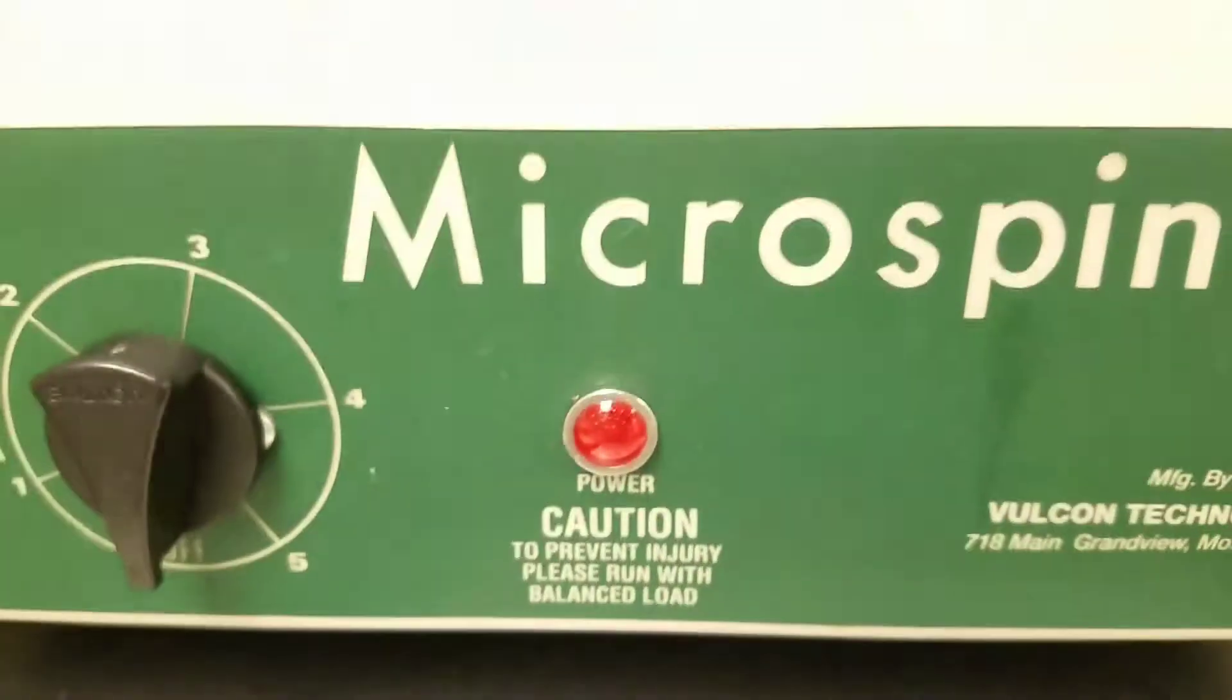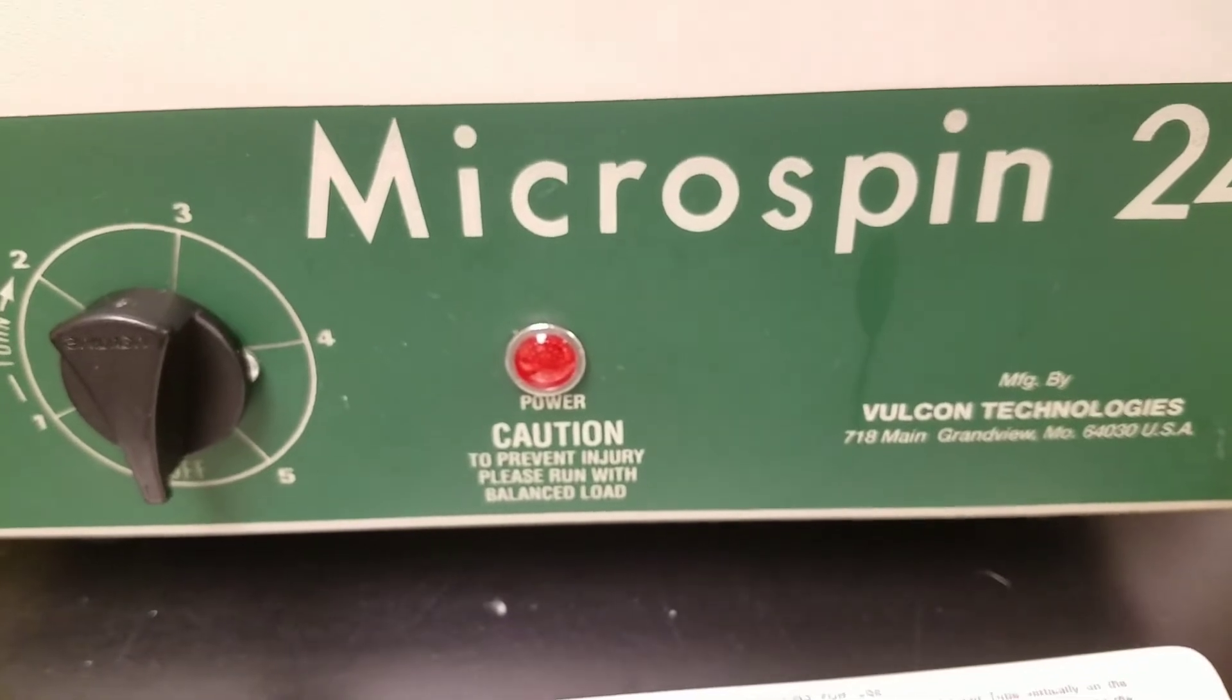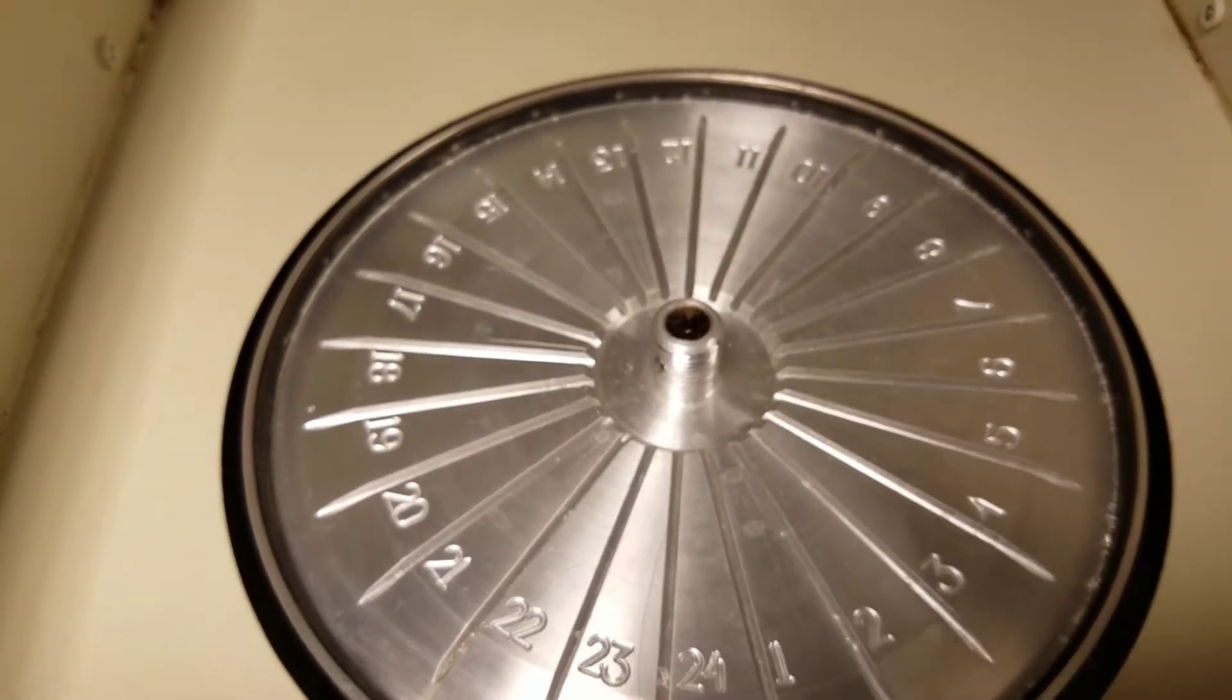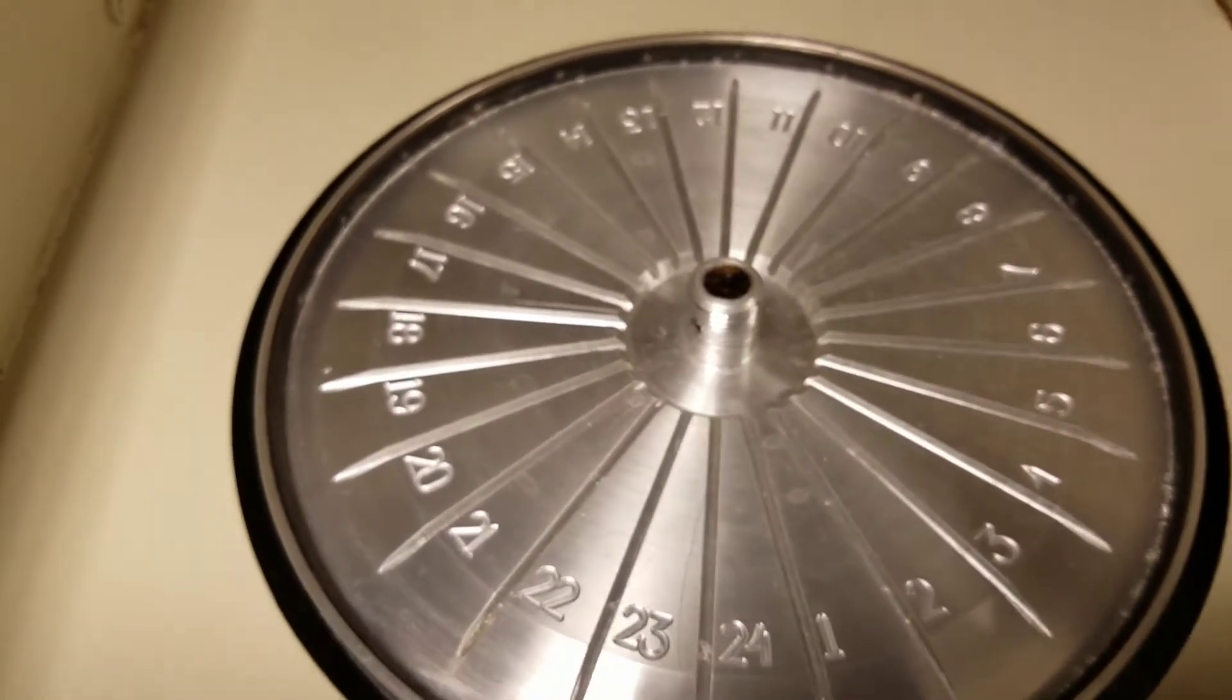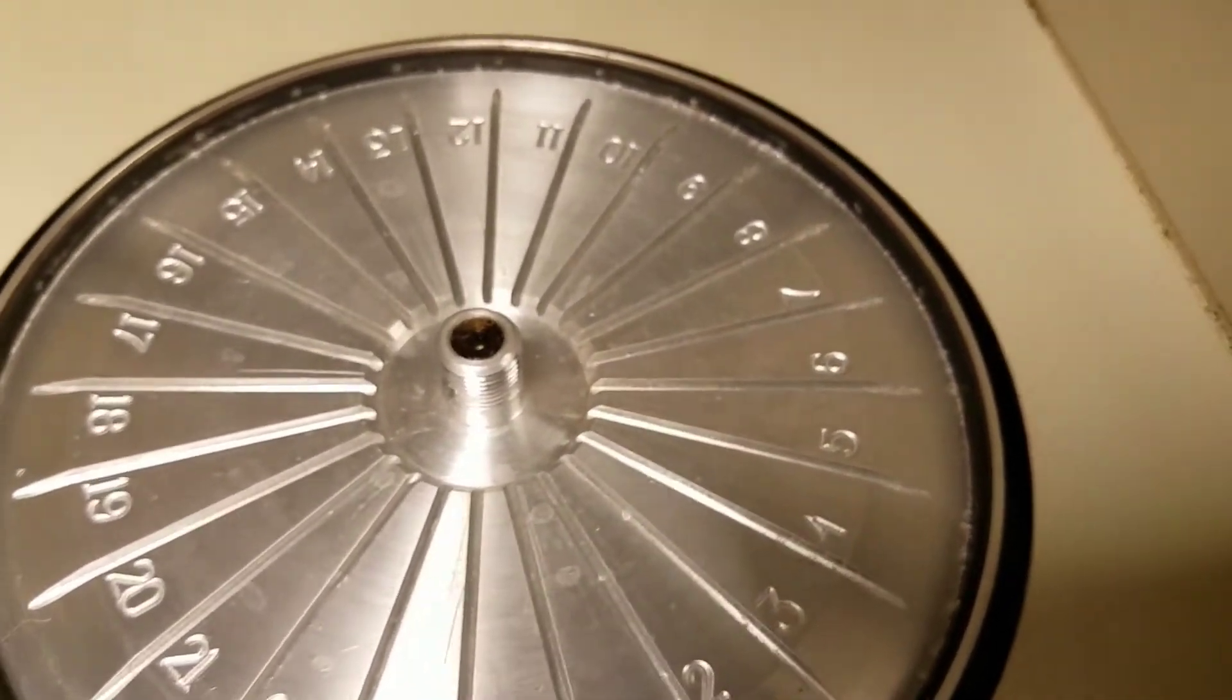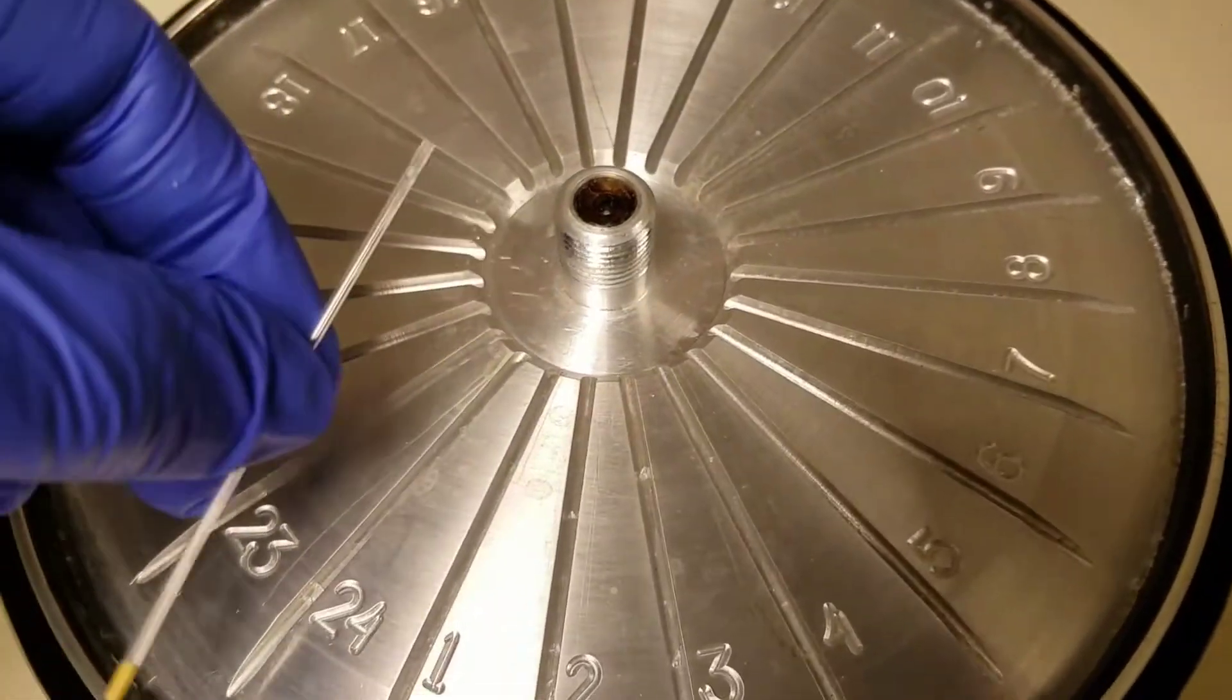You'll also need some kind of centrifuge that will spin your micro-hematocrit tubes. And this is what ours looks like. You always want to make sure your micro-spin or whatever kind of centrifuge you have is balanced.